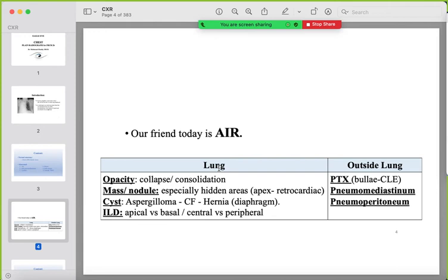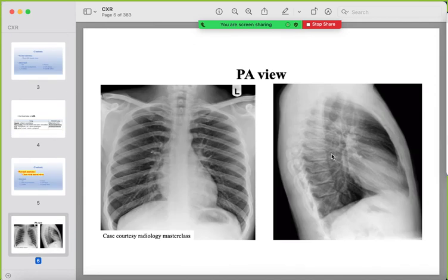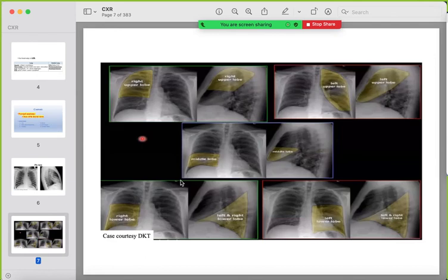Our focus today will be on air. Air inside the lung can show changes like opacities, masses, cystic changes, or interstitial lung disease. Air outside the lung could be in the pleura, mediastinum, or pneumoperitoneum — as we discussed last week for the abdomen. We will start with normal anatomy: this is the PA and lateral views of the chest radiograph.